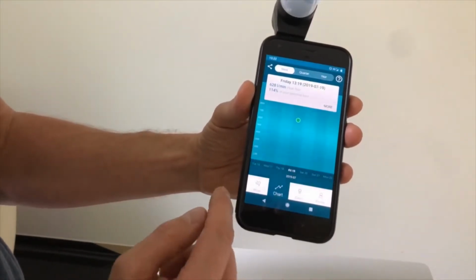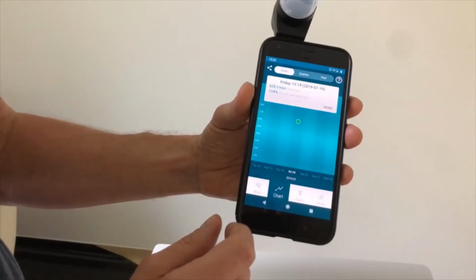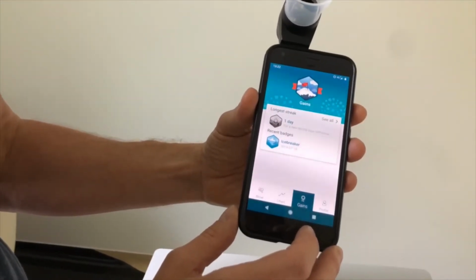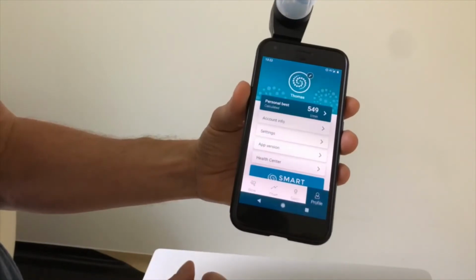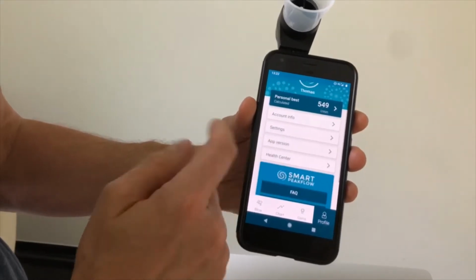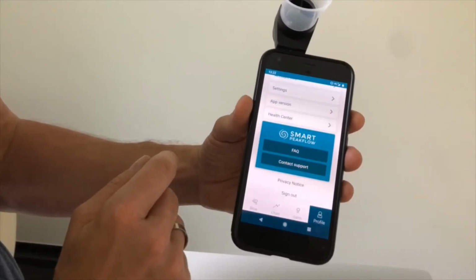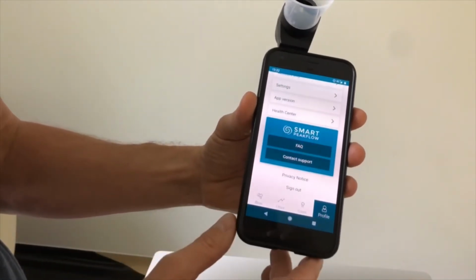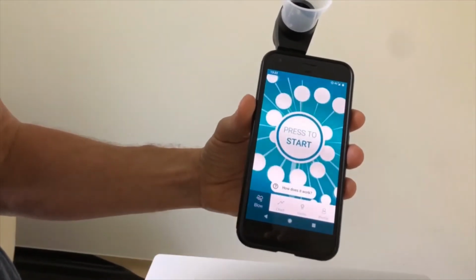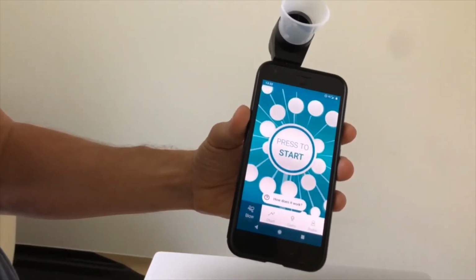So down here, looking at the tabs, we've gone through blowing, taking my measurement. We've seen the chart, which is a single point now. Again, it's showing me my badges, and I got my first icebreaker badge. And then in profile, I have a bunch of settings, including my personal best, when I get reminders, where I can contact support, answers to frequently asked questions, so all kind of useful things. But the main screen where action starts is here, the blow tab.